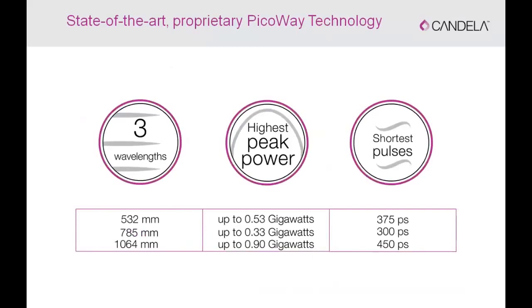It has the highest peak power, and that means that you are able to have a large spot size, and even with a large spot size, you can still generate enough fluence with a very short pulse duration. And to be able to generate very short pulse duration very much into the picosecond domain, you would need a machine that has high peak power.